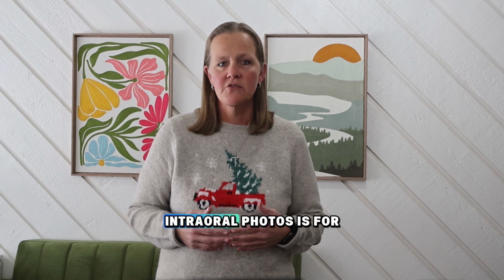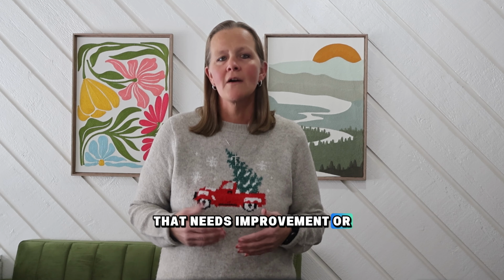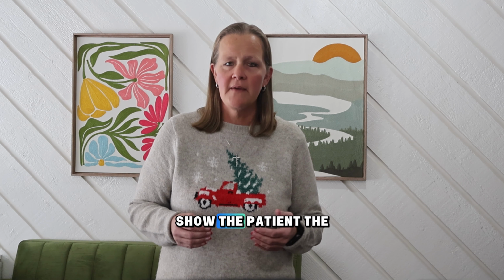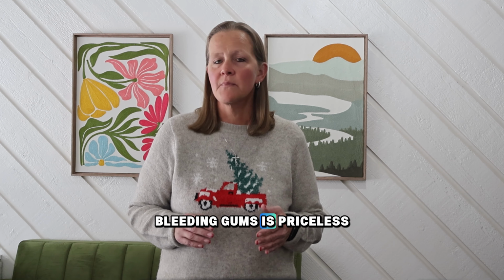Another reason we take intraoral photos is for patient education. For example, by utilizing the camera, we are able to show a patient an area of the mouth that needs improvement or extra attention when they're brushing or flossing. For instance, we might tell a patient that they are missing the back molar completely when they're brushing, but being able to show the patient the tooth covered in plaque and surrounded by red, bleeding gums is priceless.